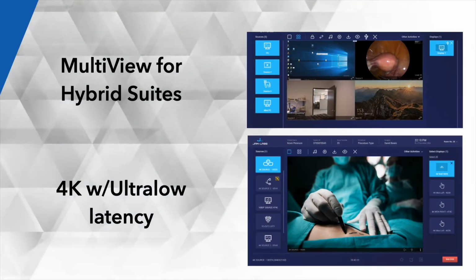Now, some of the surgeries go on for multiple hours. Some go as long as 12 hours for a neuro surgery, or a cranium surgery. So it's important for the surgeon to see a zero lag latency video. That's the benefit of having something that is non-compressed and doesn't take too much processing. And the Semtech chipset actually does a line-based encoding, which prevents it from having too much lag in the design. As it is, the displays will introduce lag, right?